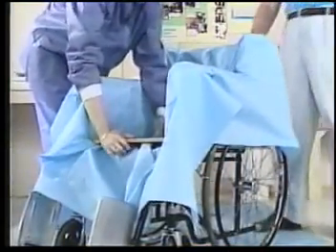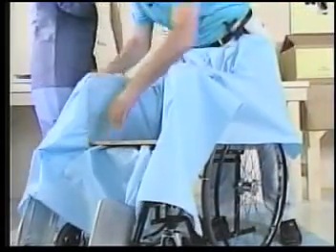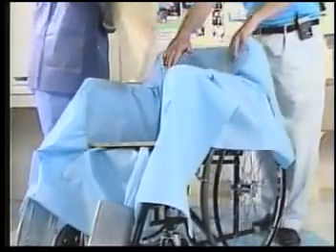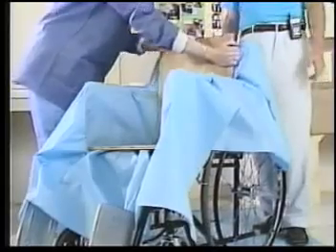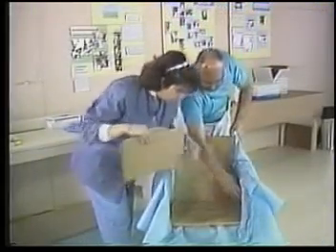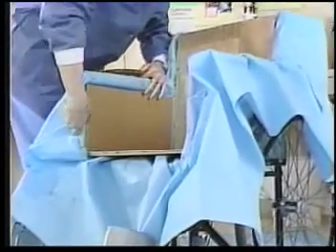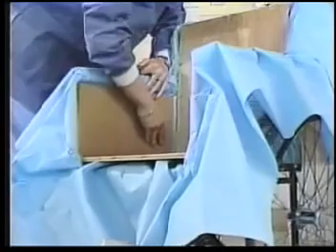For a wheelchair with a sling seat, plywood boards should be placed in the chair to provide a solid, flat foundation. Cardboard inserts should be used in the sides of the chair to confine the foam and guide it as it rises up and around the client's legs and hips.